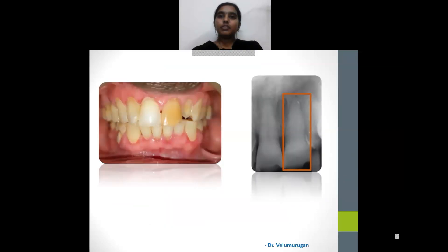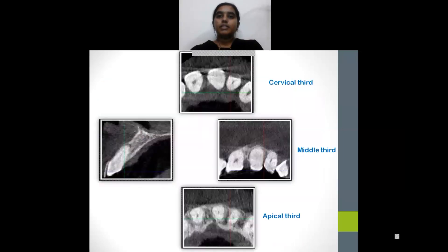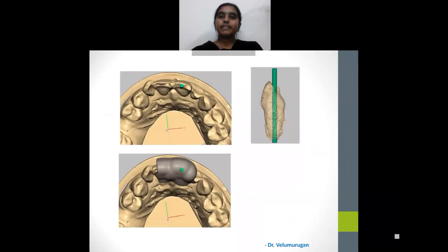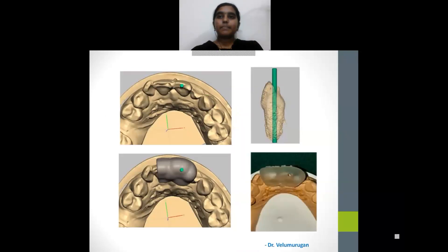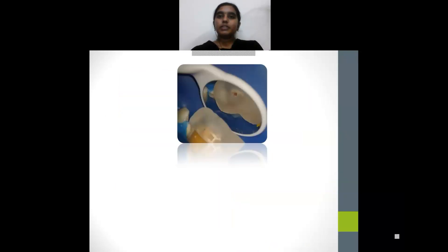Let's have a look at one of the cases: a male of 36 years with a history of trauma 10 years back presented with a discolored tooth in relation to tooth 21. The IOPA clearly reveals that the cervical third and middle third are obliterated and the patency of the canal is only present in the apical third. CBCT images and axial views also reveal patency in the apical third. The path of access opening was virtually planned and a single-tooth template was fabricated. The template is placed on the tooth and with the help of a pencil, a point is marked on the tooth surface.